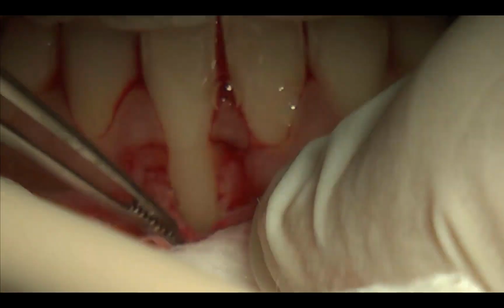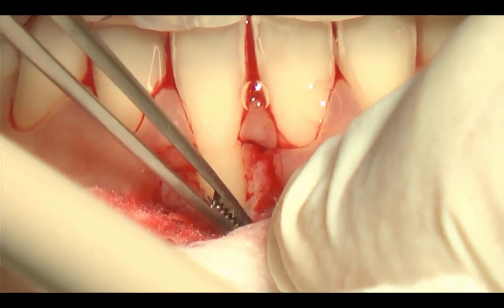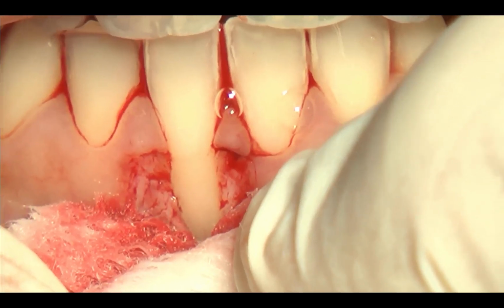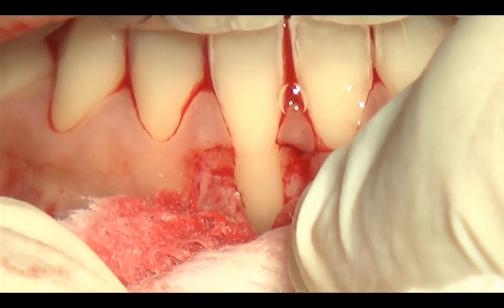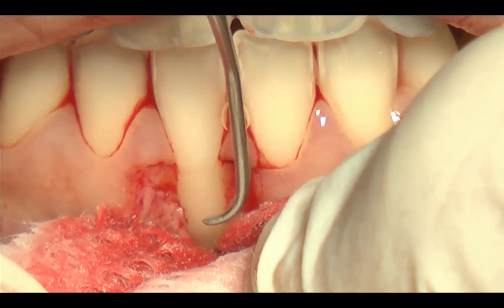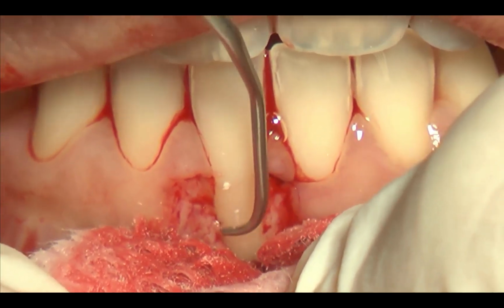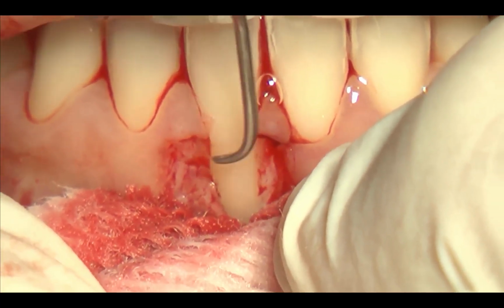With the gauze in position, you see how big is the bone dehiscence. I will make root planing only on the 3 mm coronal plus 1, which was the probing pocket depth, while the last 2 mm or even 3 of the bone dehiscence.